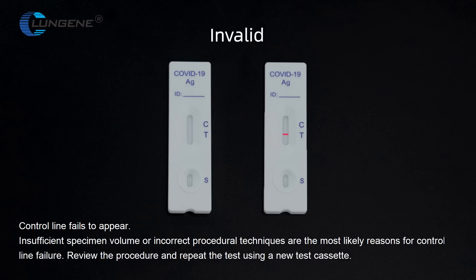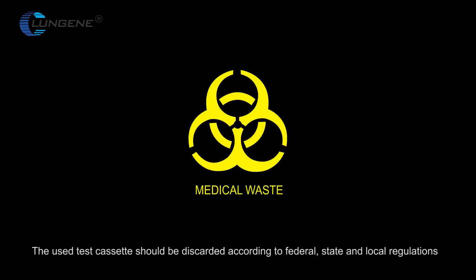Review the procedure and repeat the test using a new test cassette. The used test cassette should be discarded according to federal, state, and local regulations.